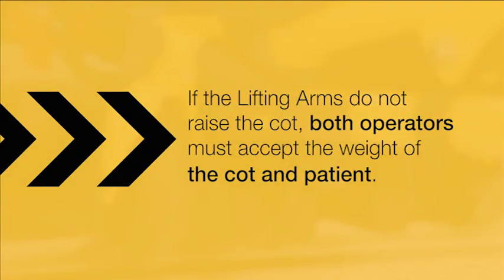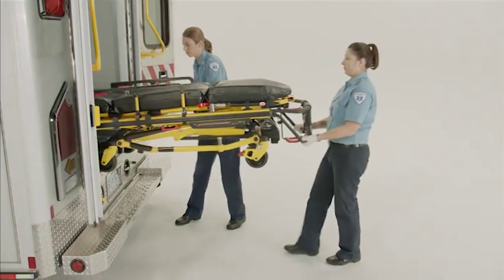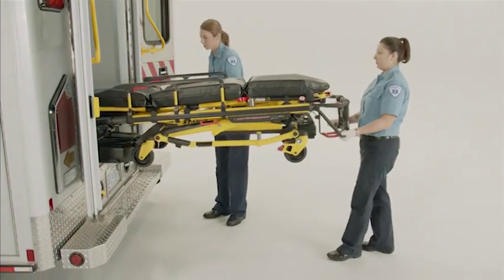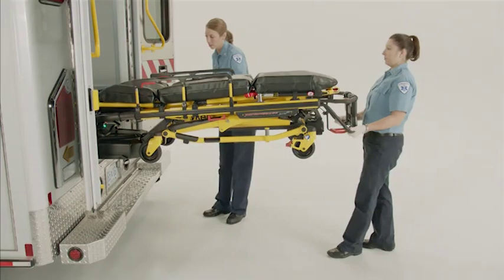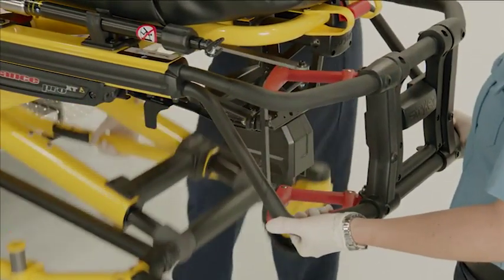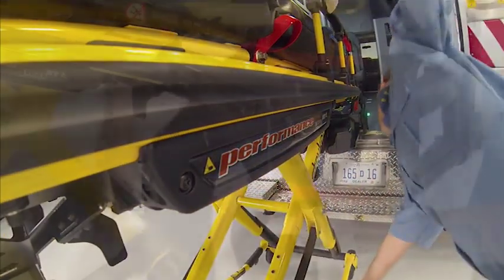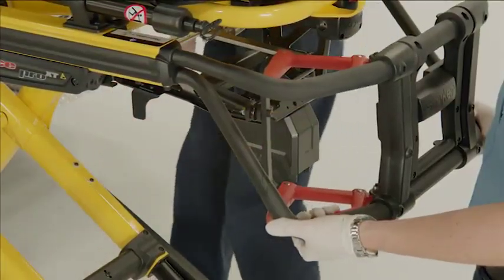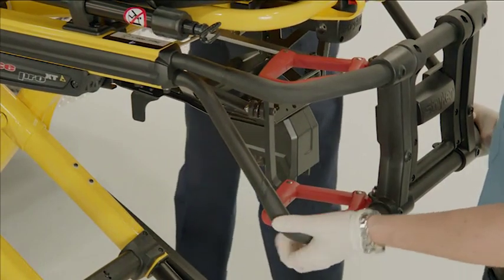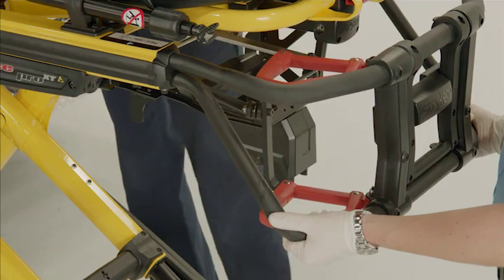If the lifting arms do not raise the cot, both operators must be ready to accept the weight of the cot and the patient. The foot-end operator will now grasp the cot frame and squeeze and hold the release handle. At the same time, the side operator will grasp the base of the frame, lift slightly, and lower it to its fully extended position. The foot-end operator will let go of the manual release and ensure that the undercarriage locks into place.